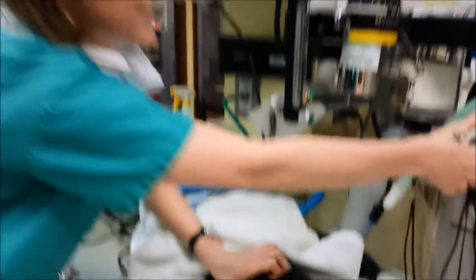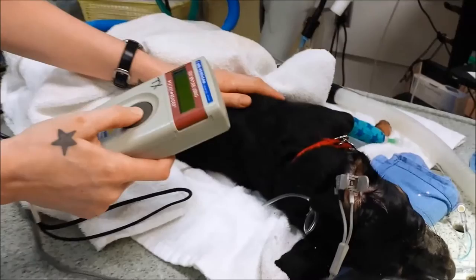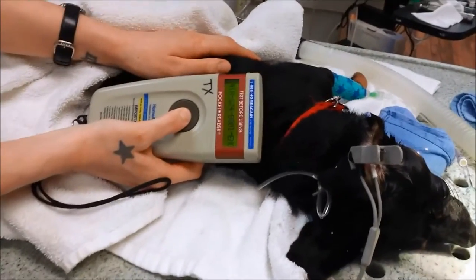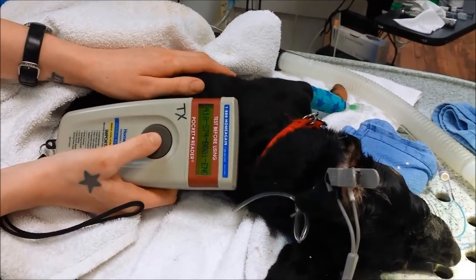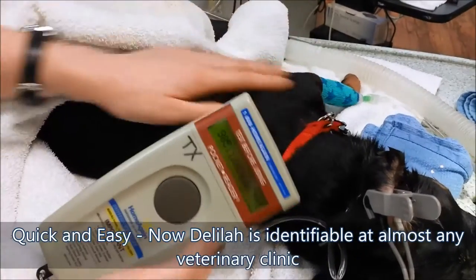Now I'm going to scan that area just to make sure it's in. There's our microchip number, and Delilah's a little bit safer.